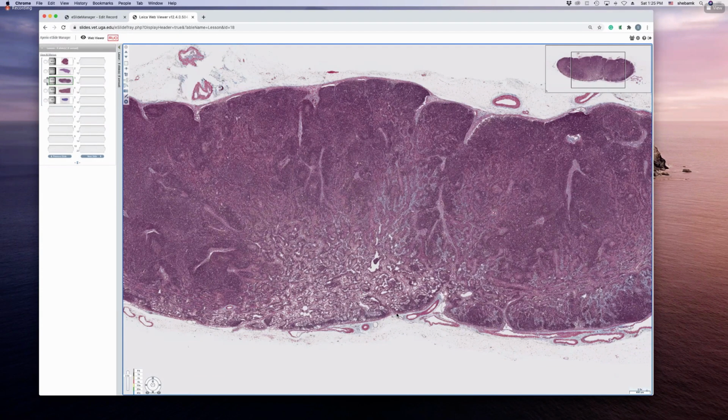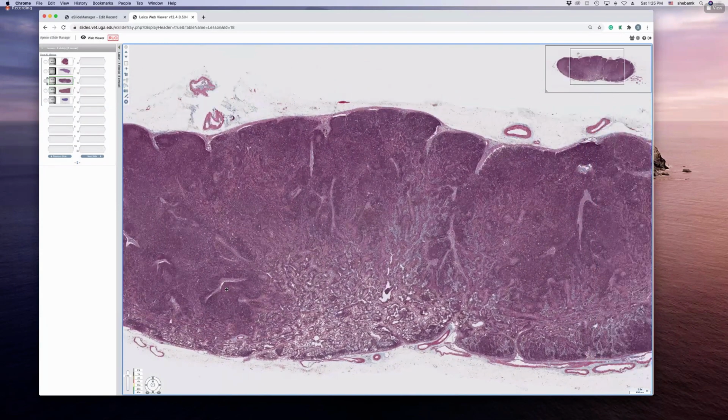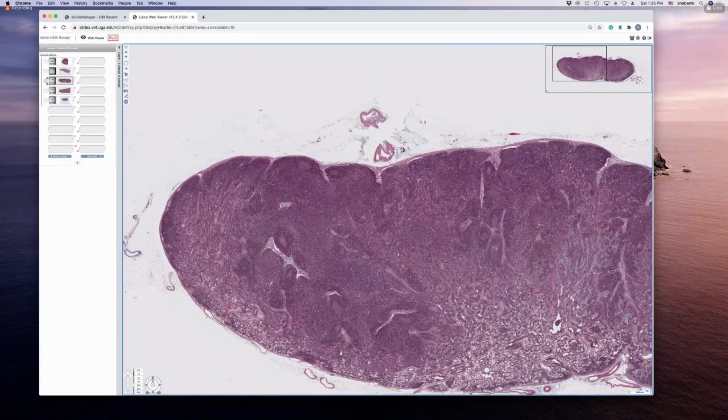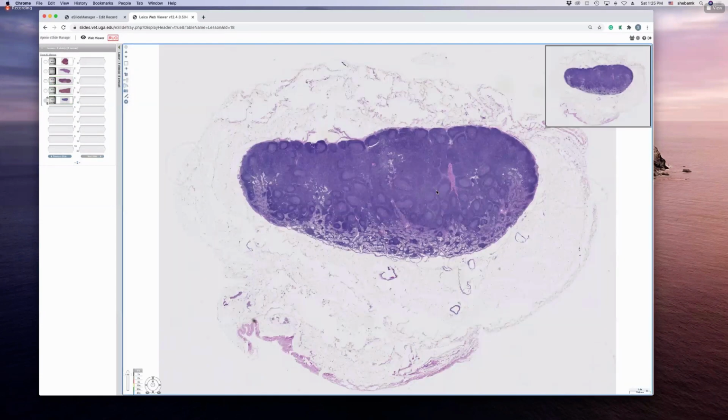So same structures, but this is a much quieter lymphatic nodule. You don't see too many activated nodules here. Okay, so this is a quieter lymph node compared to this one here, which is more reactive. Okay, so that's the lymph node.